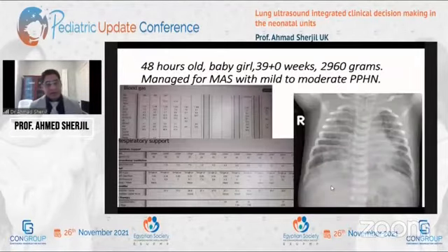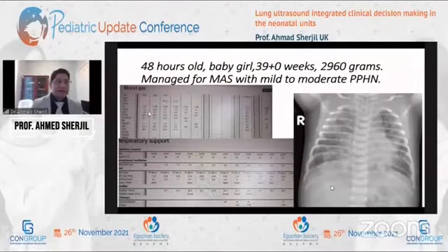The other one was a meconium aspiration syndrome girl who was 2 days old. So have a look at the X-ray. It looks exciting. If you look at the pH here, initial after birth pH 7.1 with a double figure PCO2, so a decent bit of respiratory acidosis. This baby was 48 hours old when I saw her. At the time when this baby was admitted, if you can follow the arrow, see the oxygen requirement, it was pretty high. And when I reviewed the baby, it was still 37-38% documented here.